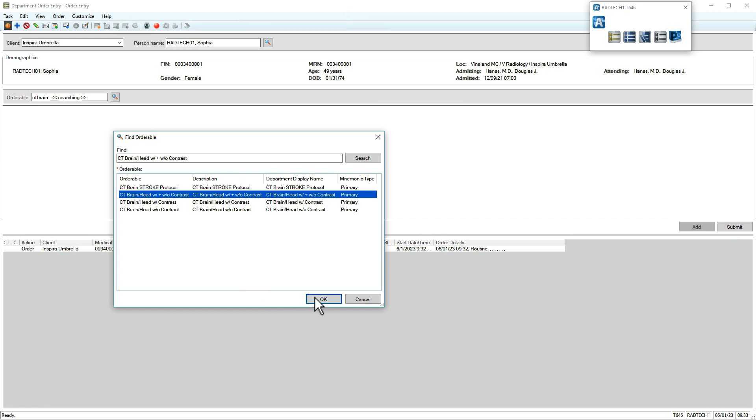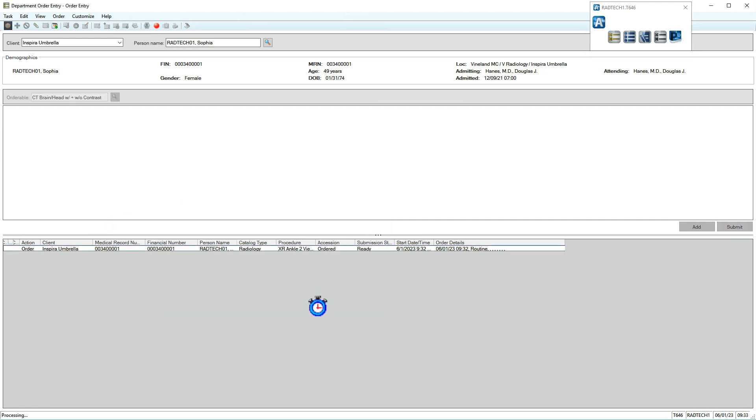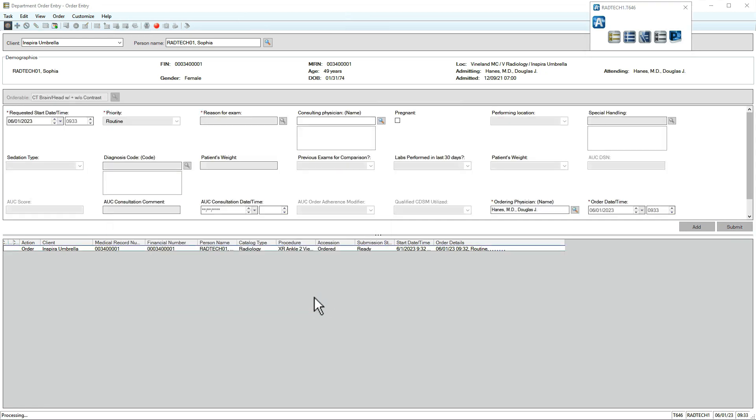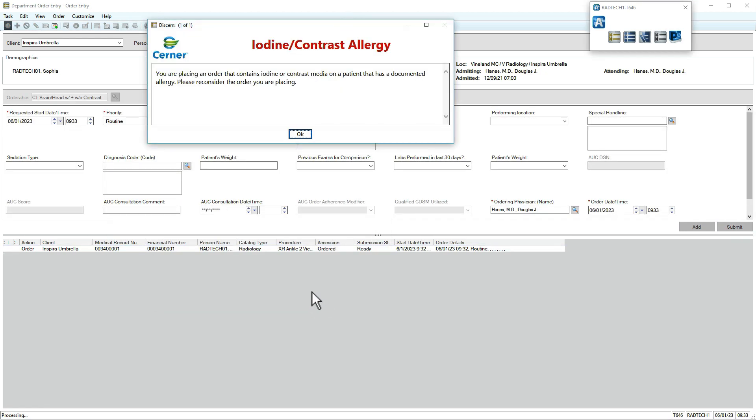If the patient has a documented allergy, you may see a warning. Take appropriate action or inform the patient's physician as needed.